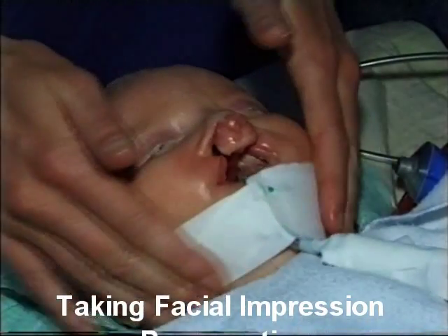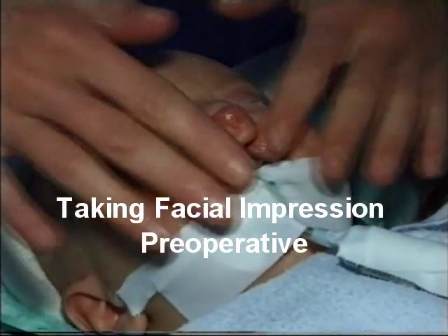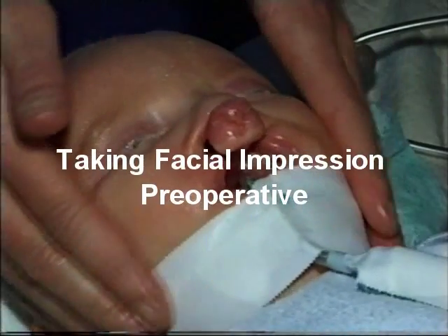Taking the facial impression, starting with putting Vaseline on the face of the patient.